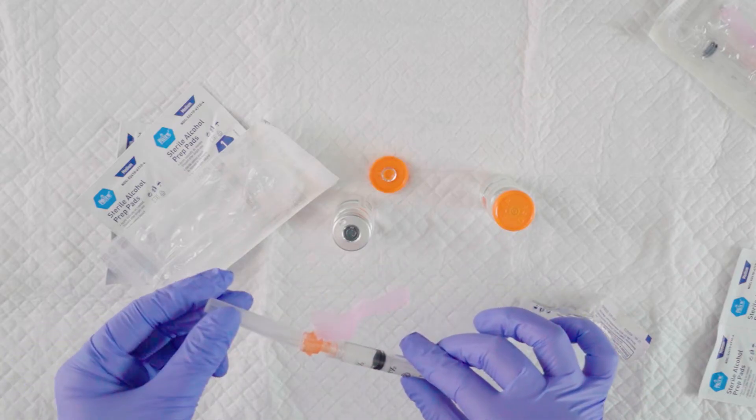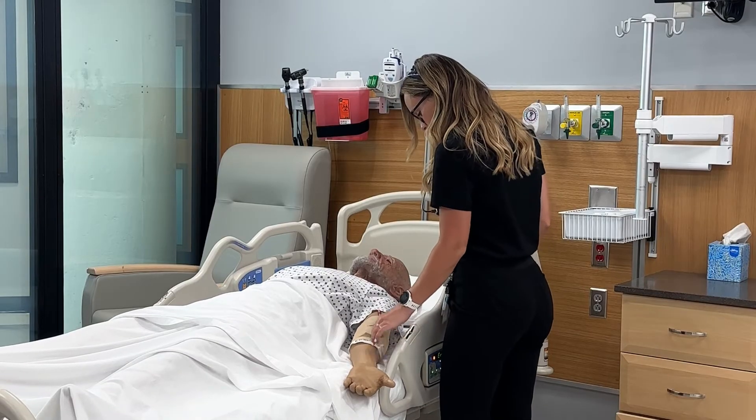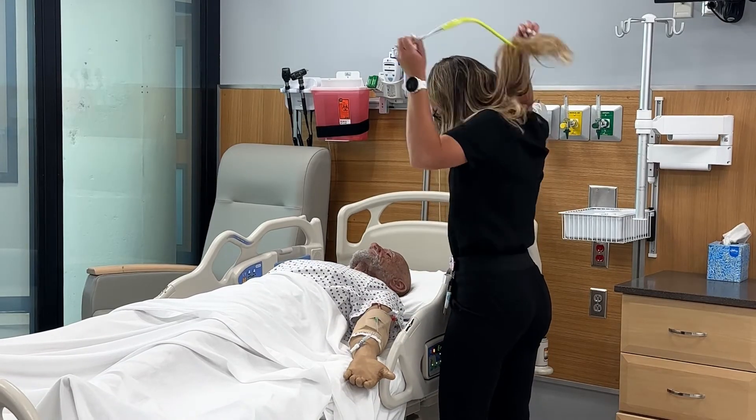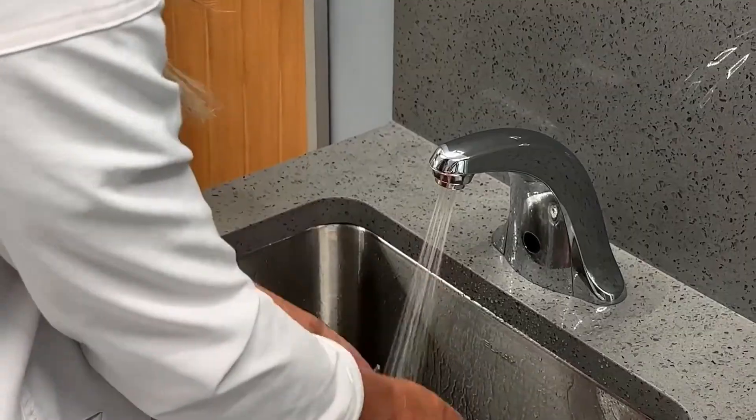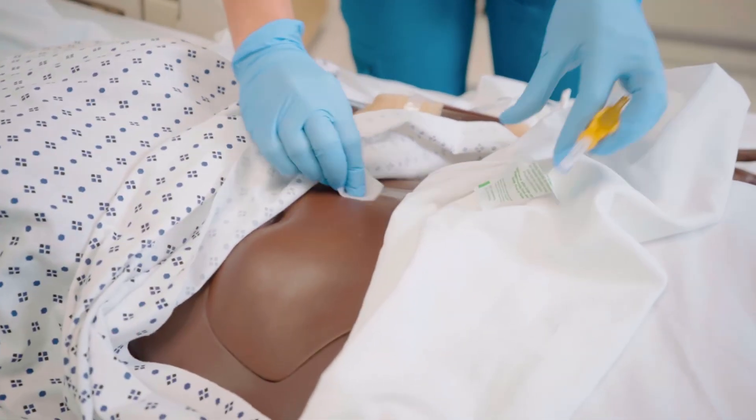Before administering the medication, review where the last injection was given to be sure the sites are rotated. Then perform hand hygiene again and put on gloves. Be sure to clean the site with an alcohol prep pad.